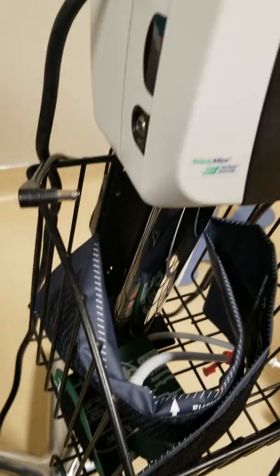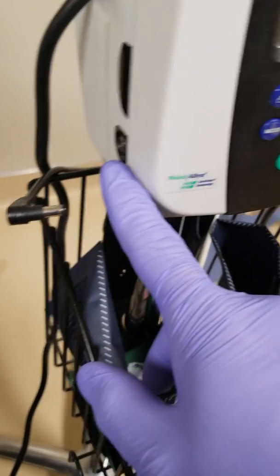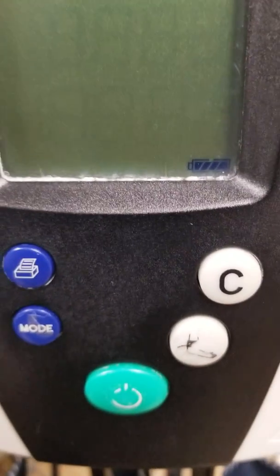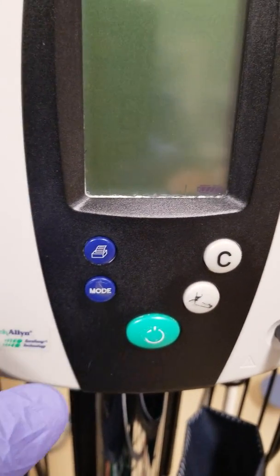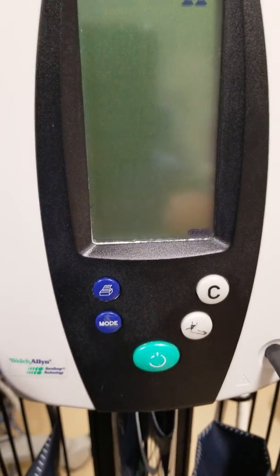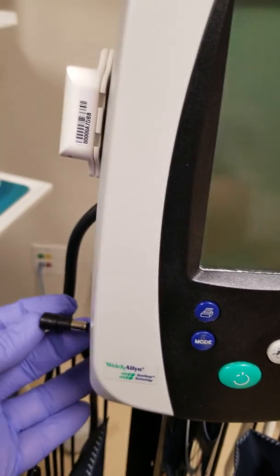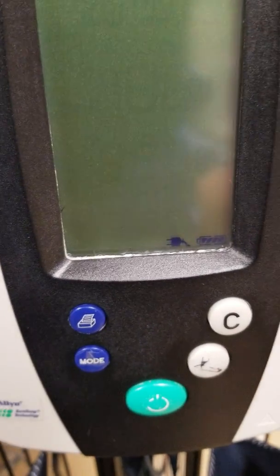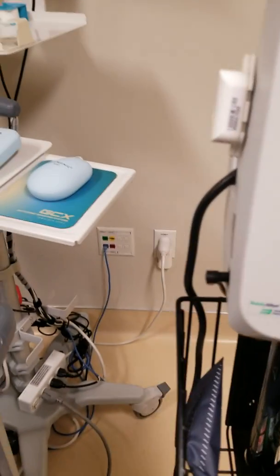Make sure the charger is connected — this one was unplugged. The battery indicator here: when it's solid like this, it's either fully charged or running on battery. Once you plug it in, as you can see, there's our indicator — that means it's plugged in and we've got power coming in charging the battery.